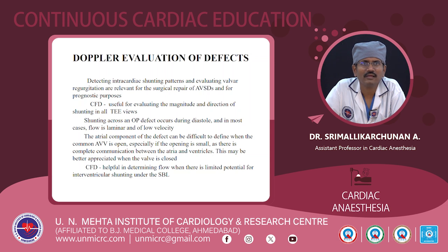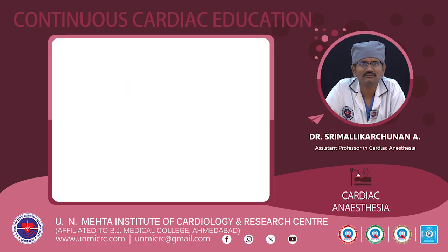Color flow Doppler helps in determining flow when there is limited potential for interventricular shunting under the superior bridging leaflets.